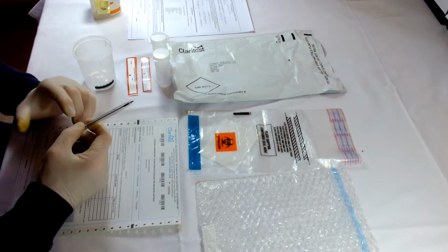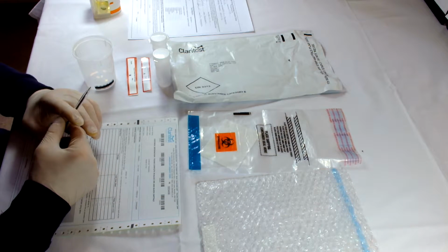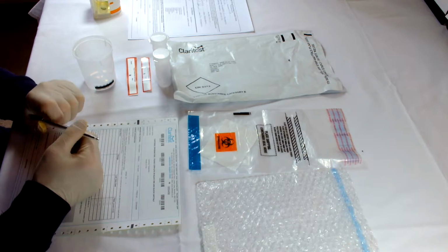Now, the laboratory will generally want to deal with the same person at your company all the while, so the person who needs to receive the results, that would generally be their email that goes in there, and then the name of the collector. Then there's a section that asks reason for testing, and there could be several.